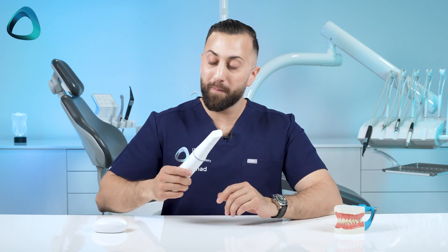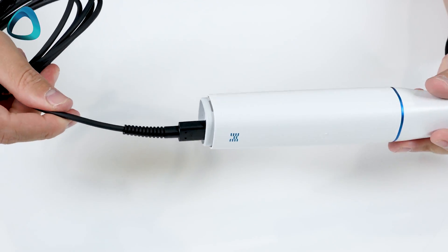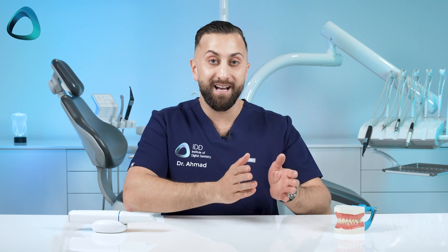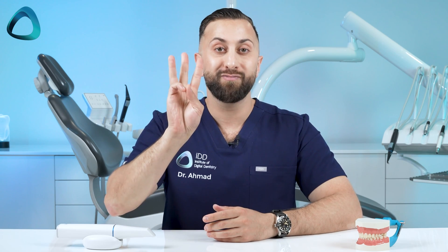And lastly, we have the new and improved USB-C cable. Yes, this is a wired scanner, and the company has also improved the cable's durability. It's a simple USB-C connection that connects your scanner to your laptop with no power plug or connection hub required — one simple cable connection. The baseline warranty is also extended from one year to three years, so Medit wants you to have a seamless and hassle-free experience from start to finish.